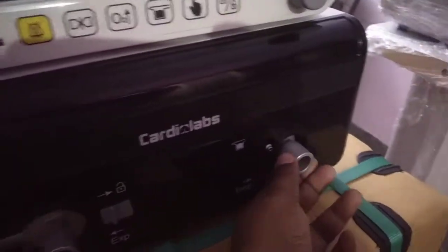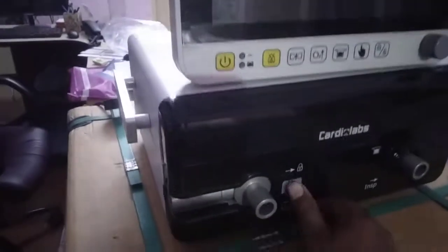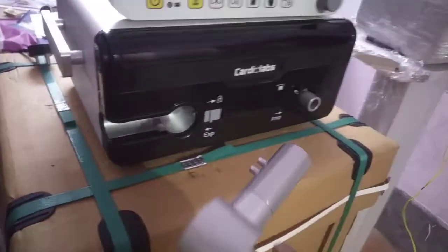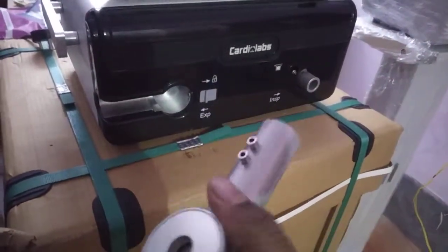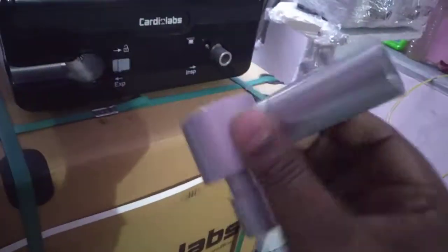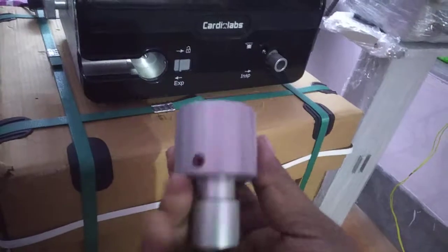This is your inspiratory port, this is your nebulizer port, and this is your expiratory port. To open the expiratory port, just press this and it will come out. This is your expiratory valve and this is your flow sensor. The best part is the whole set is autoclaveable, so there is no significant running cost — no replaceable flow sensor.